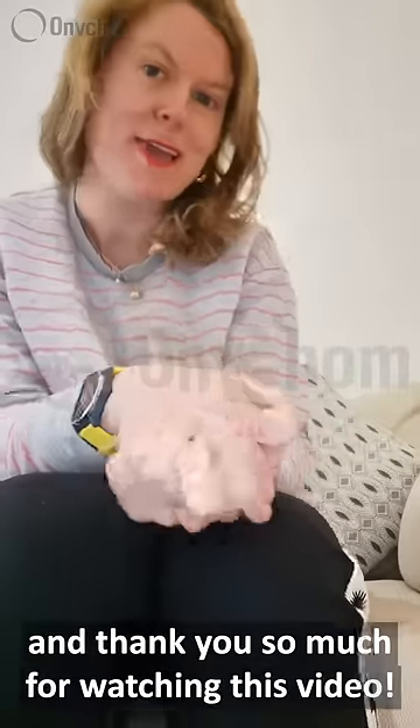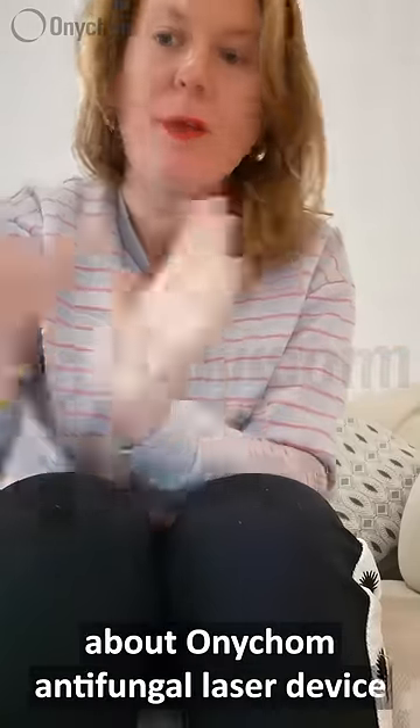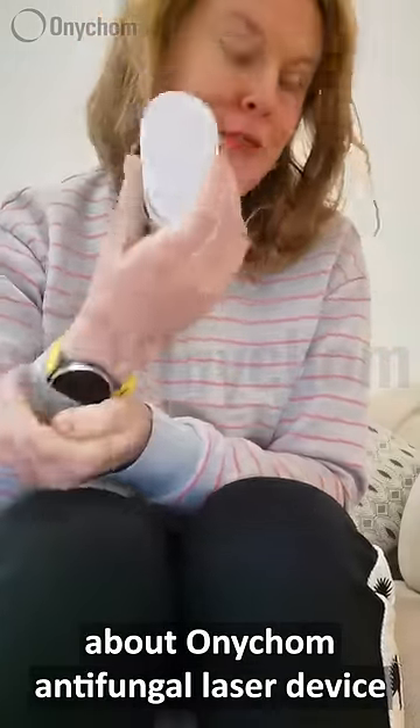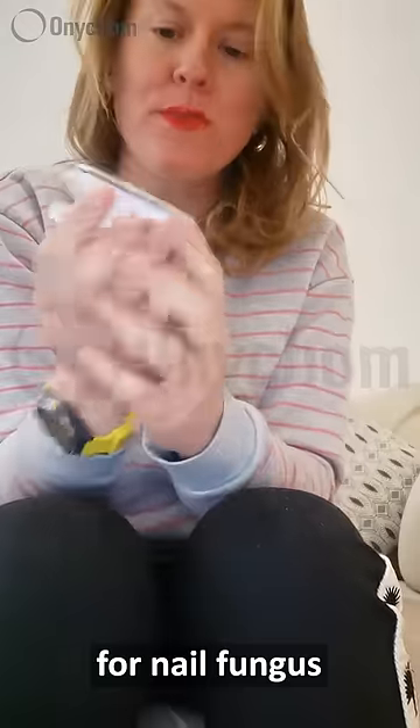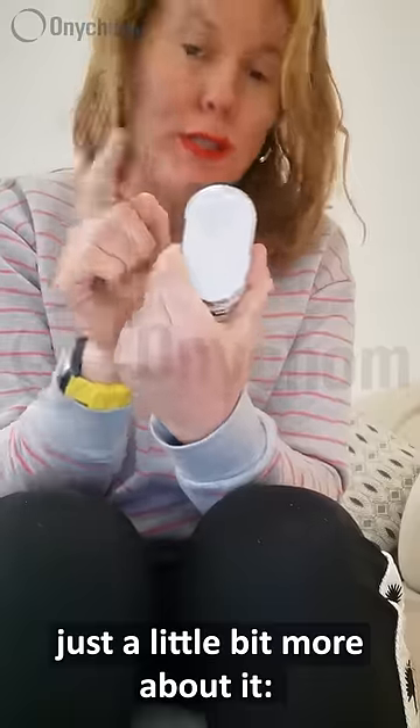Hello everyone, my name is Cecilia and thank you so much for watching this video. I wanted to talk to you today about the Onicom antifungal laser device for nail fungus, and before I actually demonstrate how to use it, just a little bit more about it.